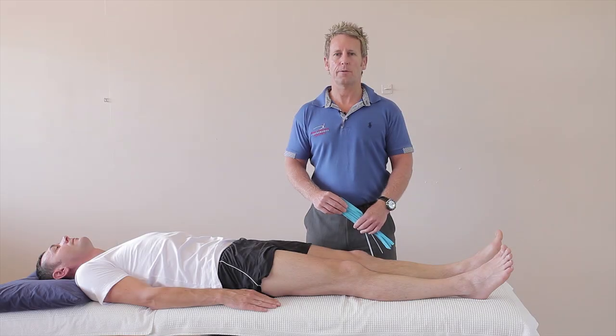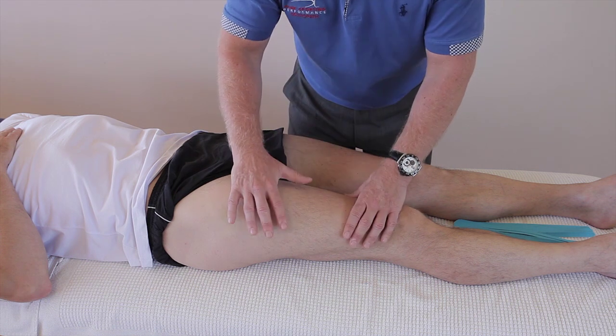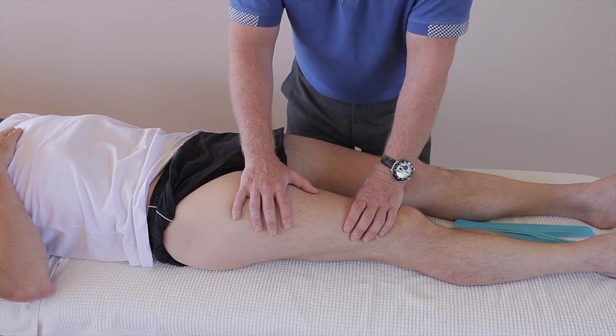In this video we're going to look at a taping for a hematoma or swelling of a quadricep muscle group. Contusions to the lateral side of a leg are very common in sports, especially in rugby.